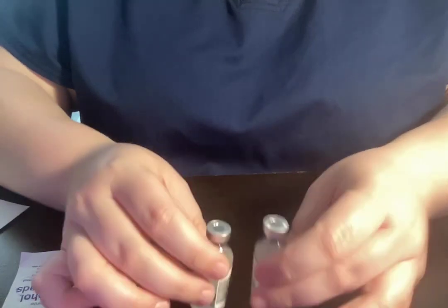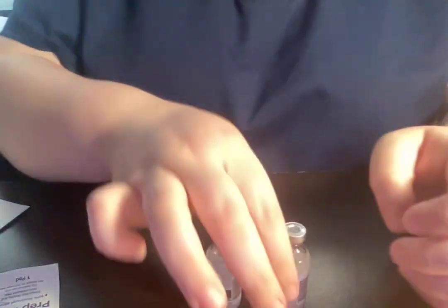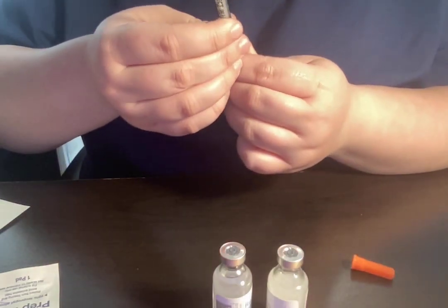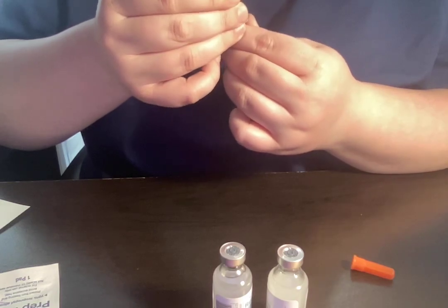So again, I'm going to check to make sure the insulin I have is what the doctor ordered. I'm going to clean both of them. The doctor has ordered 10 units of NPH and 5 units of regular.